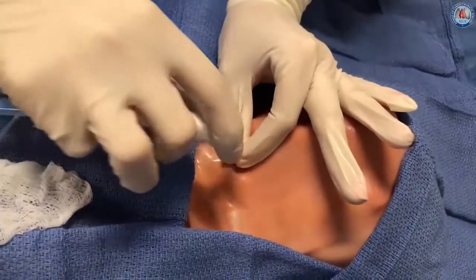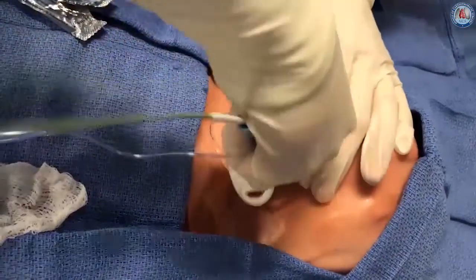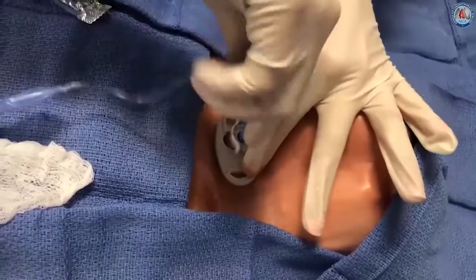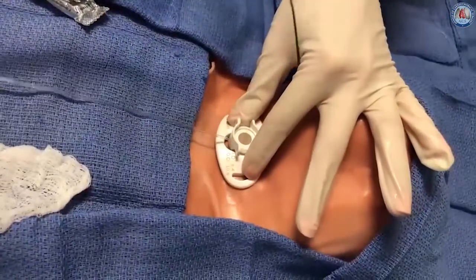The number 8 cuffed tracheostomy tube pre-loaded on the 28 French dilator is advanced as a unit into the trachea over the guiding catheter and guide wire. The guiding catheter, guide wire, and dilator are then withdrawn.